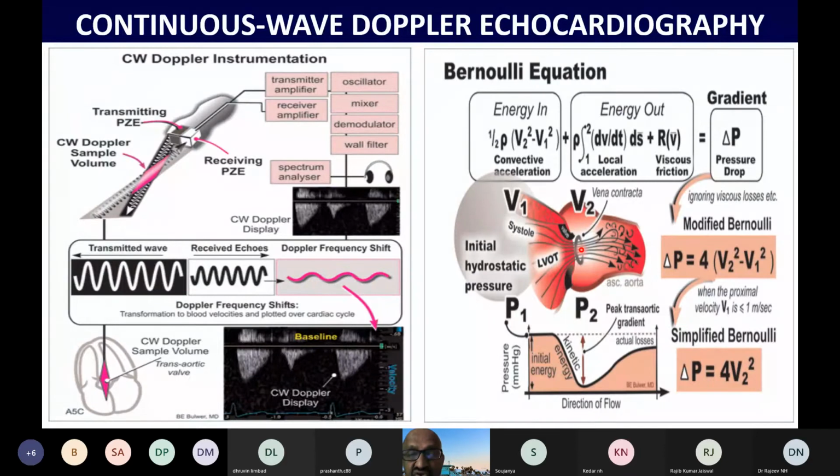So we are putting a catheter into the LV, measuring the LV systolic pressure, and then pulling it into the aortic root and measuring the aortic peak pressure. Because we are measuring the peak to peak pressure, this will be lower than the instantaneous pressure measured by echocardiography. This is one reason why the pressure gradient by echocardiography is higher. The second reason is the phenomenon called pressure recovery.